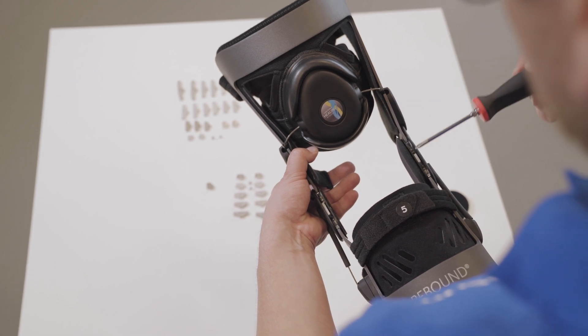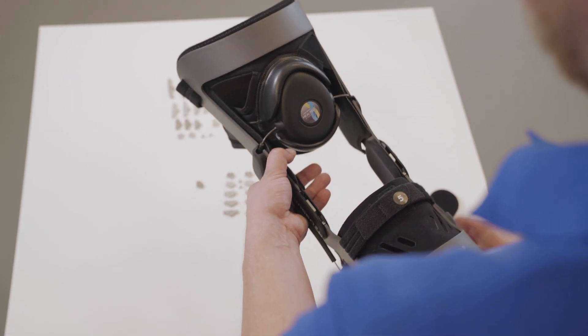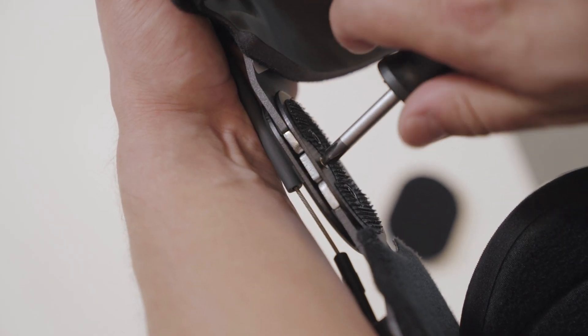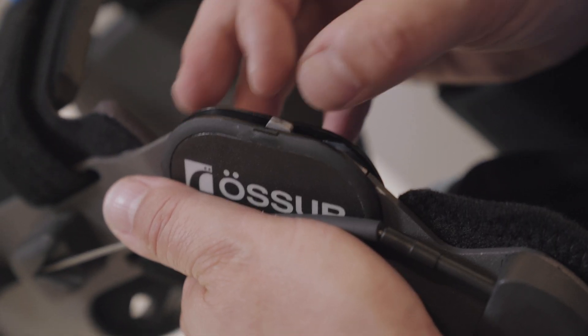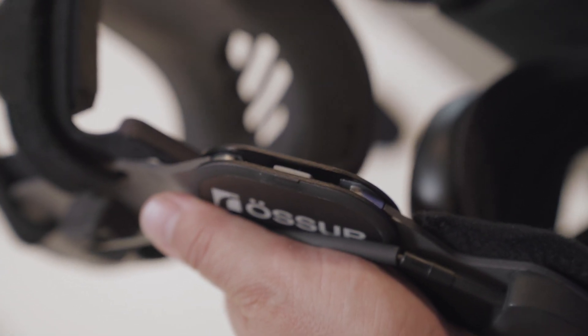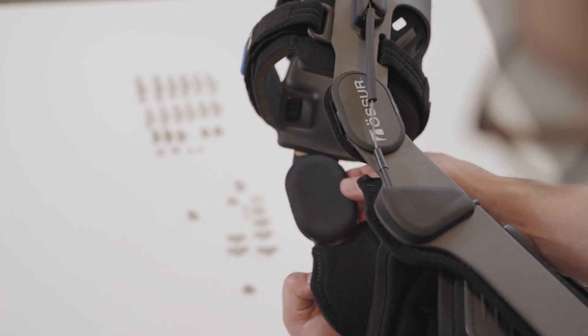Ensure that both sides contain the same degree of flexion stop. Follow the same procedure to change the extension stops. Reinstall the condyle pads.